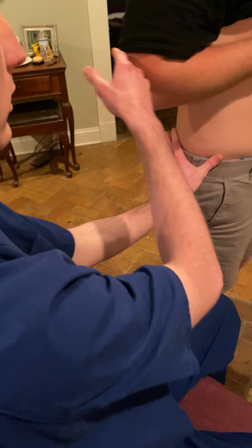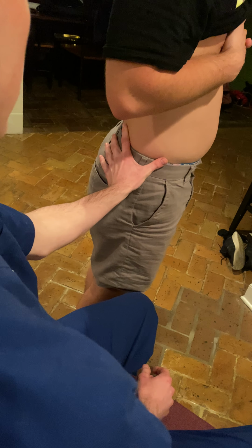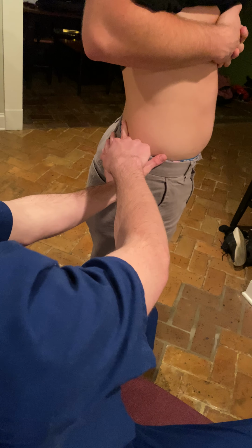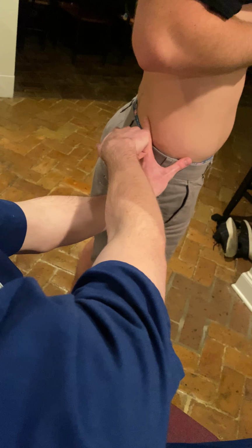Could you turn this way a little bit? So my middle finger would go along the iliac crest, which is towards the buttocks, and my index finger and middle finger would make a V, and the injection site would be in between the V.